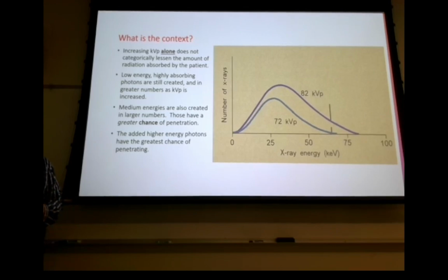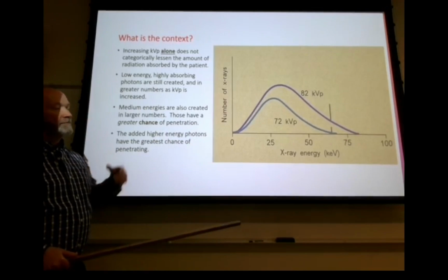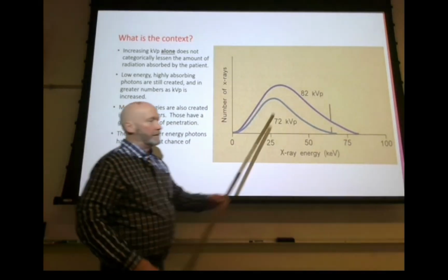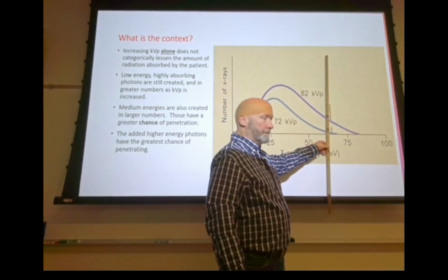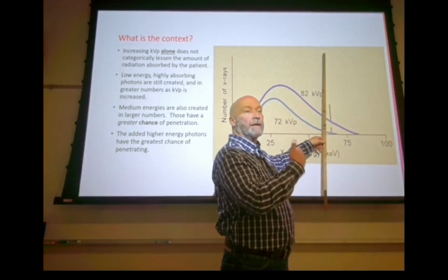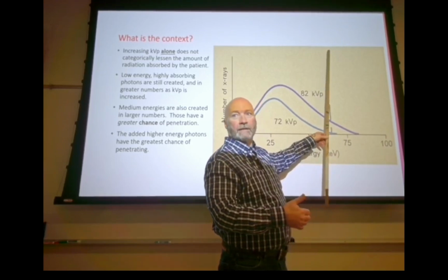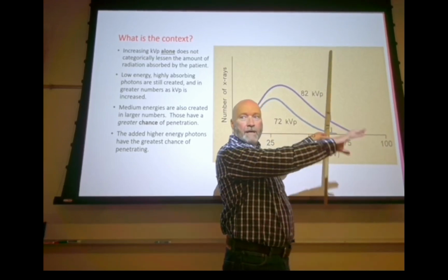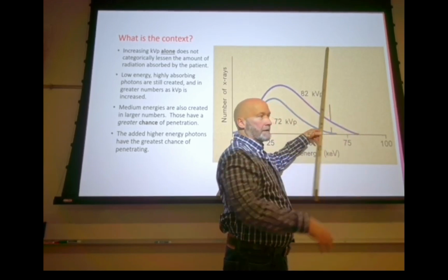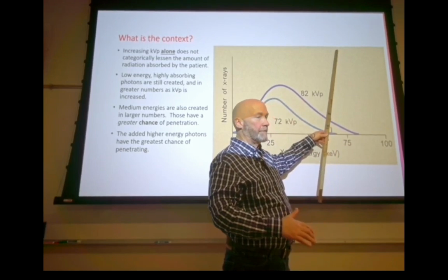Okay? So what in that then is most likely to penetrate? High energy. The high energy, right. So those high energy photons, are they less likely to interact with the patient? Yes. Absolutely. The higher the kVp, the lower the interaction inside the patient.